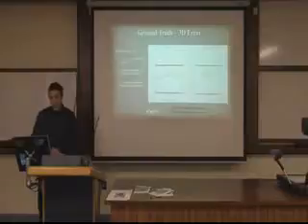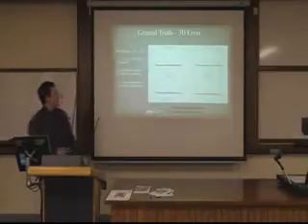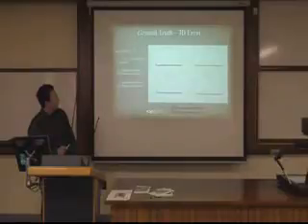One of the phantoms I didn't mention: we constructed a phantom that we independently measured with an optical comparator, so we could form a ground truth. Each point on these plots represents the algorithm output, the measured output from the optical comparator, and then the difference between those. You can see that what we're talking about there is 0.15 of a millimetre.